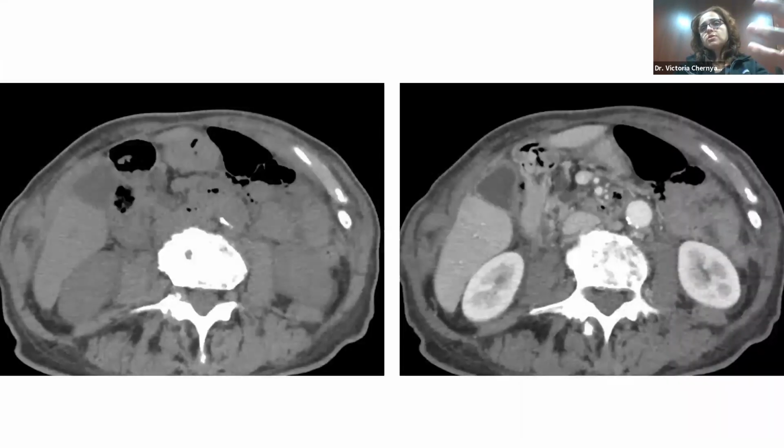When this same exact patient was placed on CT, now you can see this lesion, because again, it's a very fast acquisition time. They're able to hold still, and now you can definitively say that the cystic lesion has no solid components. So in some cases, a good CT is going to be a better diagnostic study than a bad MRI.